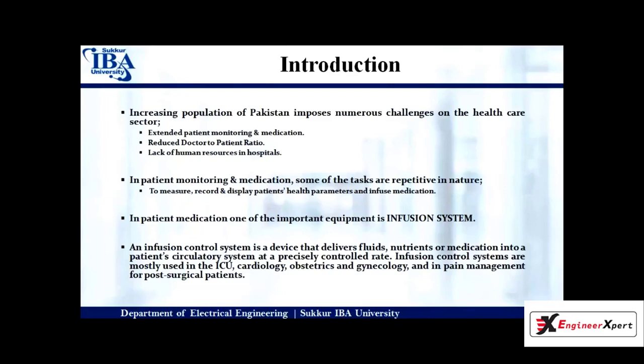Infusion control system is used to deliver fluid and nutrition to a patient at a precise rate. Those are mostly used in the ICU, and for pain management for post-surgical patients.